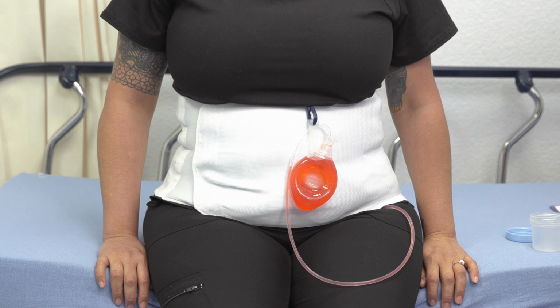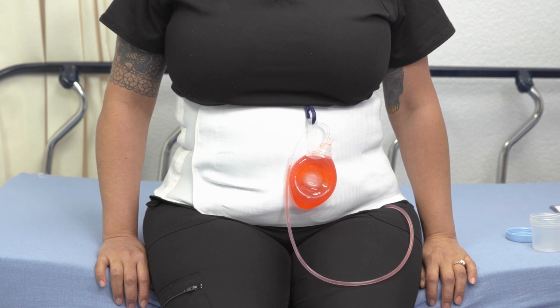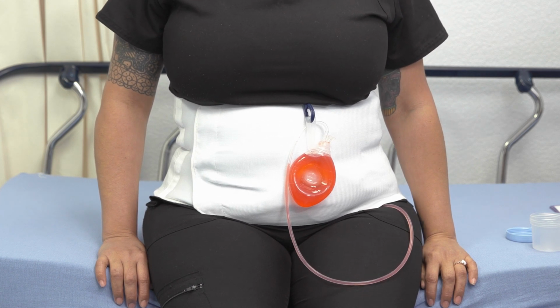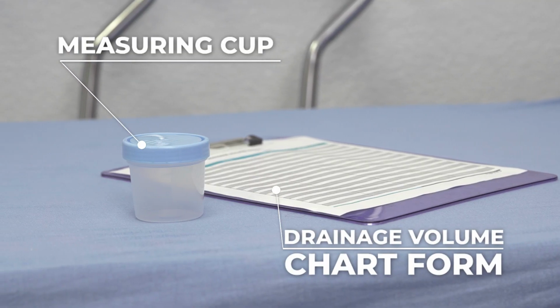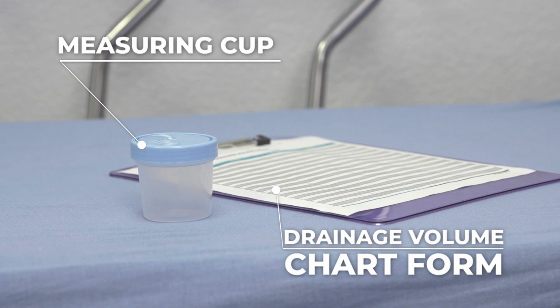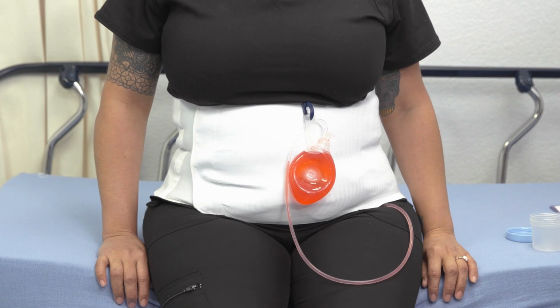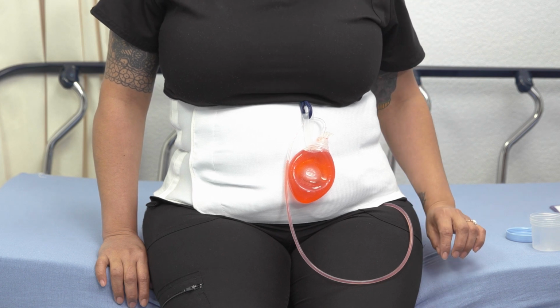Okay, so from the patient's perspective, in case your caregiver is not available to help you with your drain care and maintenance, this is how it is done. You are going to make sure you have all your supplies, which include the measuring cup to dump the drainage in and measure it, and the form to fill in once you've measured the drainage to keep it documented. Once you have your measuring cup, you're going to stage it next to yourself so it's easy to reach.